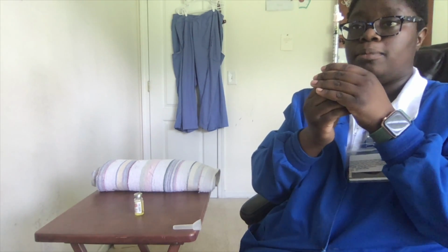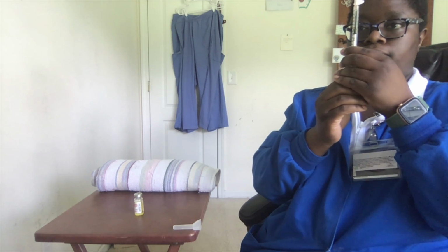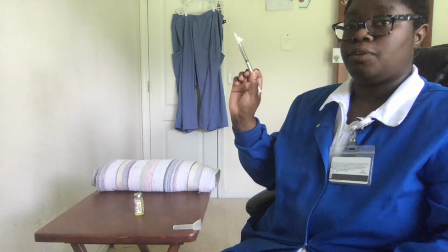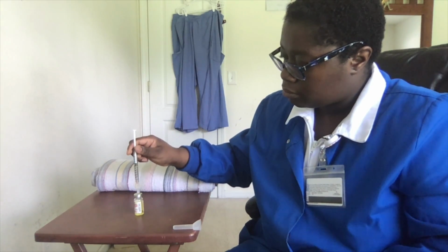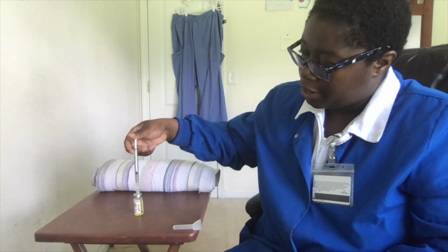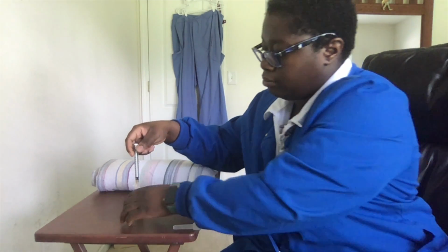To give myself some room for potential air bubbles, I'm going to pull back the plunger to 0.6 milliliters. And then, once I have the excess fluid, I'm going to push the excess fluid back up so I go back to 0.5 milliliters. I am now dispensing the air in the barrel into the air in the vial.